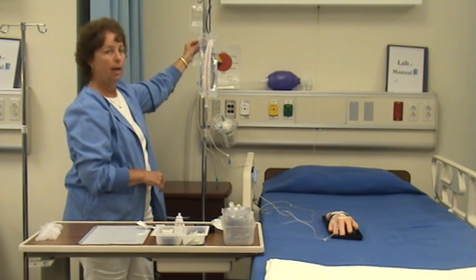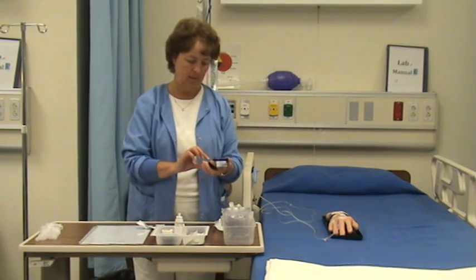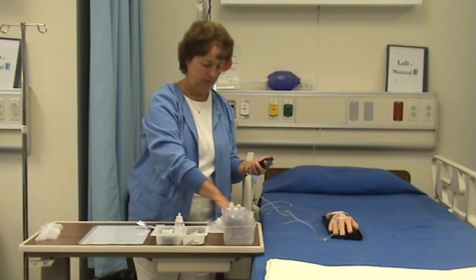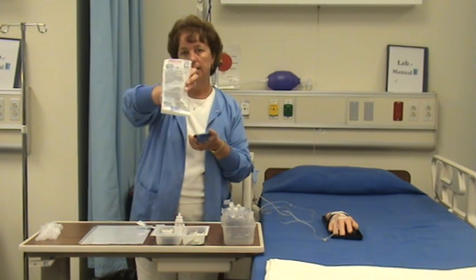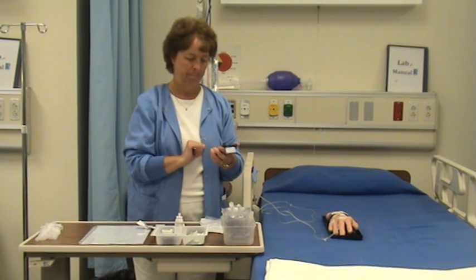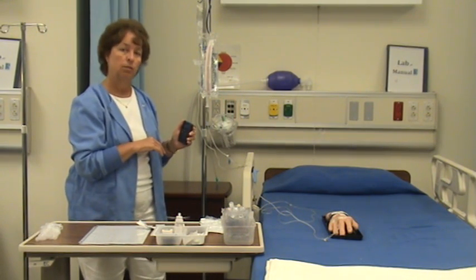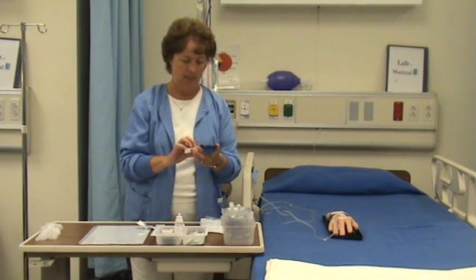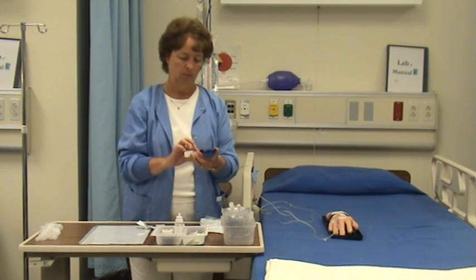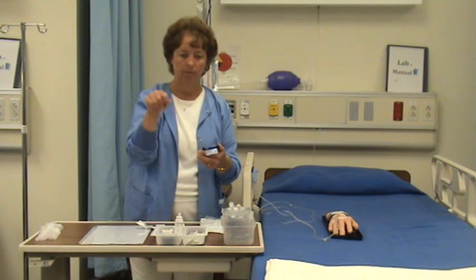We have an IV piggyback of 100 milliliters over 30 minutes. So the way that I calculate that, and I have my calculator, it's 100 milliliters times the drop factor, which is 10. If you look on the bag, it tells you the drop factor is 10. That equals 1,000. And then we're going to divide that by the minutes. And we've already said that we're going to give this over 30 minutes. So if we divide by 30, that's going to be 33 drops per minute, which every 15 seconds is approximately 8 or 9 drops every 15 seconds.